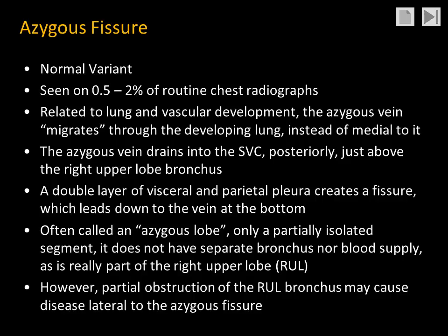Its formation is related to the development of the normal lung and the surrounding vasculature. In a patient who has an azygous fissure, the azygous vein abnormally migrates through the developing lung instead of medial to it. The azygous vein drains normally into the posterior superior vena cava, just above the right upper lobe bronchus.